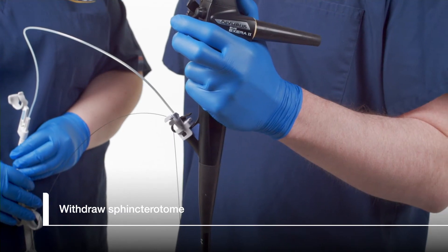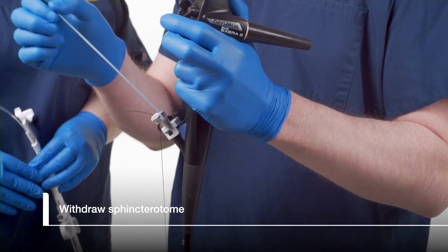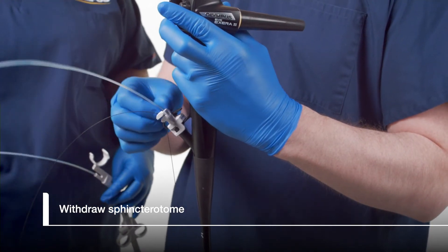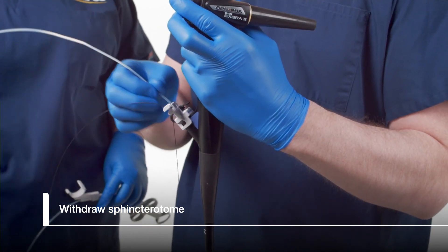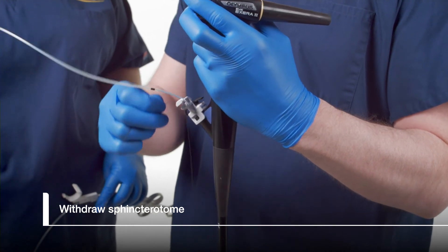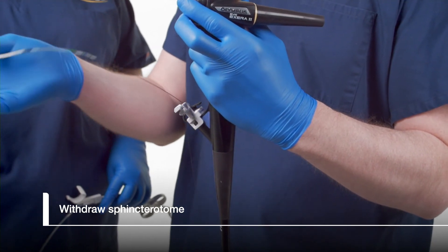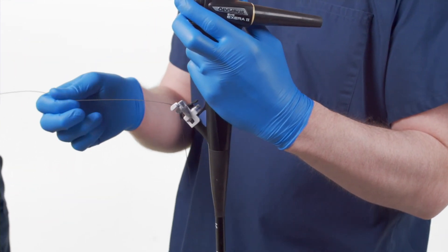Withdraw the sphincteratome catheter until the first C-channel marker reaches the locked guide wire. Unlock the guide wire by reversing the locking motion. Use the V lock on the duodenoscope elevator to maintain guide wire access in the bile duct. Continue withdrawing the sphincteratome until it clears the biopsy cap, and then lock the guide wire in CleverLock once again.